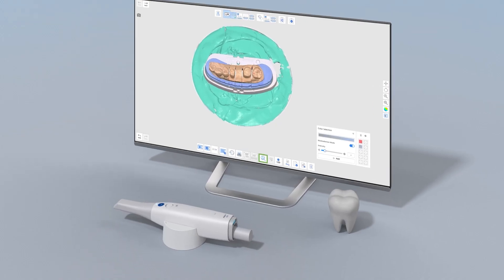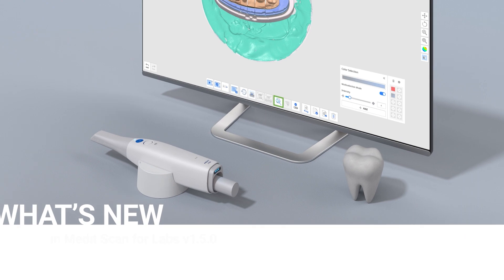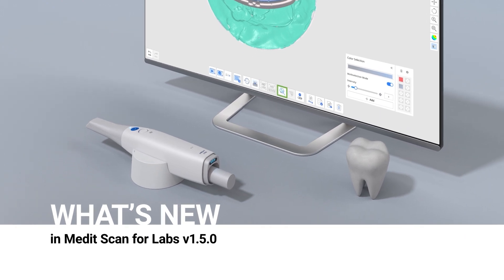This was a brief overview of what's new in MeditScan for Labs, version 1.5. Update your Medit Link now and see the release notes for more details.